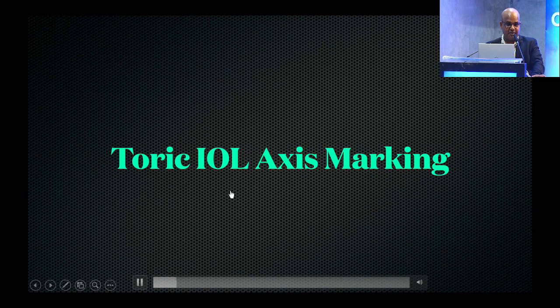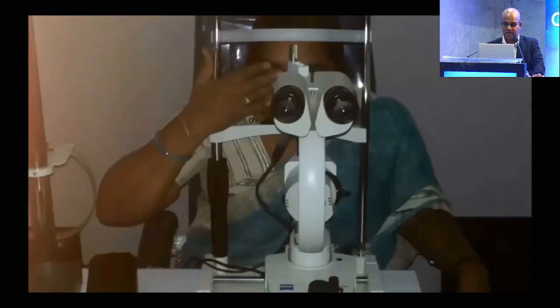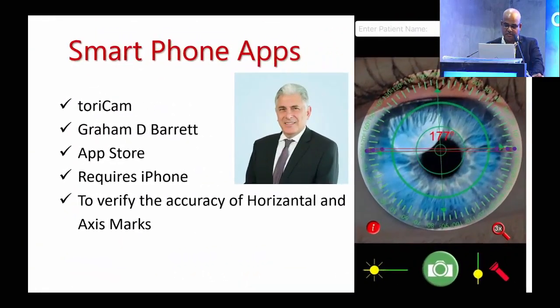I preoperatively mark the intended axis. I don't usually mark the horizontal; I directly mark the intended axis for the IOL implantation. After putting the paracaine, we need to ask the patient to look into the slit lamp beam. After putting paracaine or after drying the conjunctiva, we can mark the nasal side and temporal side.